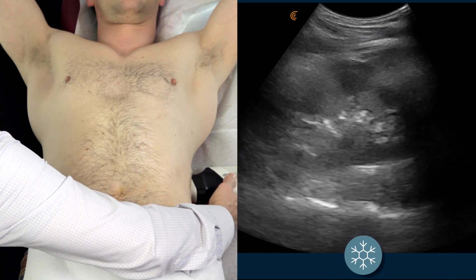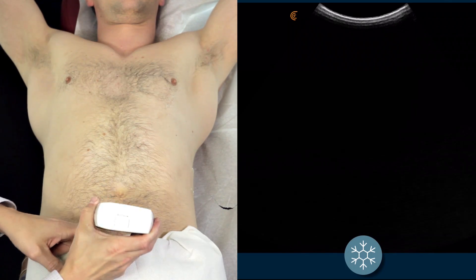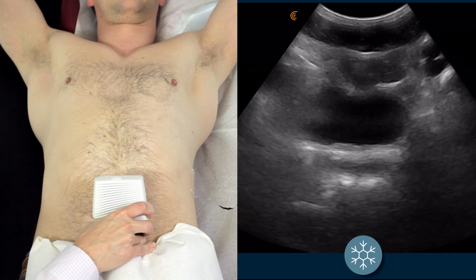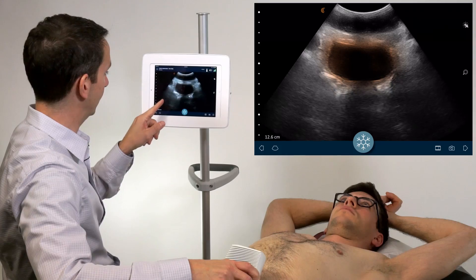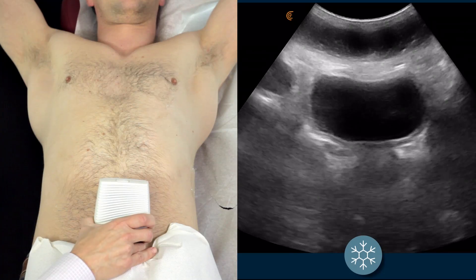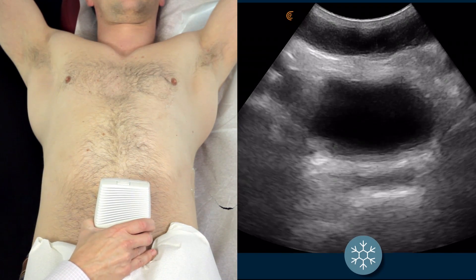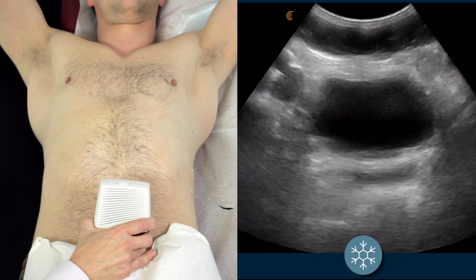When you are finished with your assessment of the left kidney, bring the scanner down to the bladder. You may need to tip the scanner down in order to identify the bladder. Perform a nice slow sweep through the bladder, assessing it and also assessing the junction spaces of the ureters.